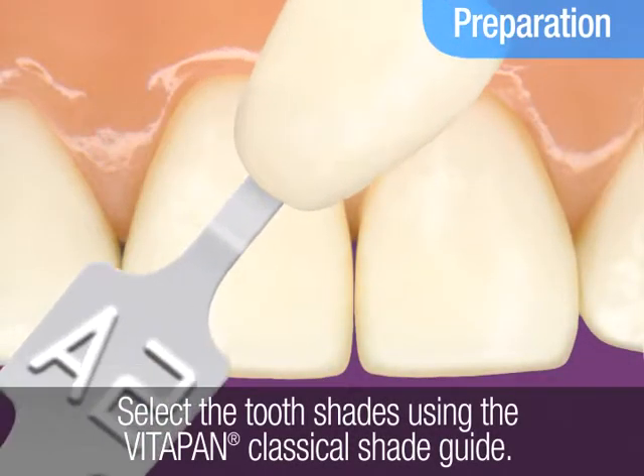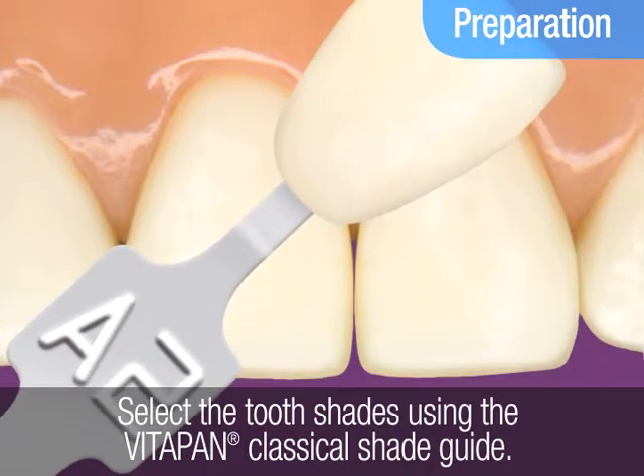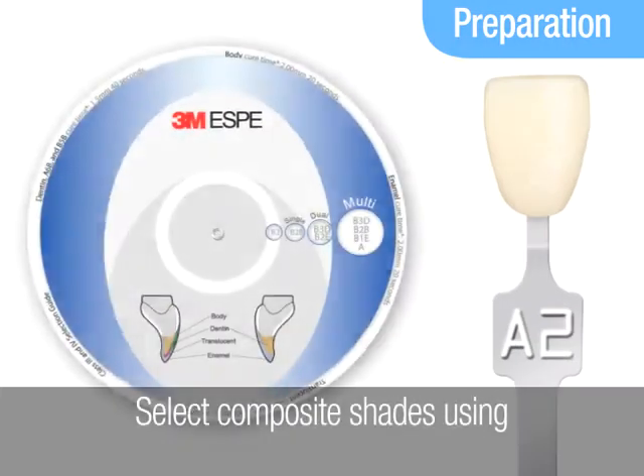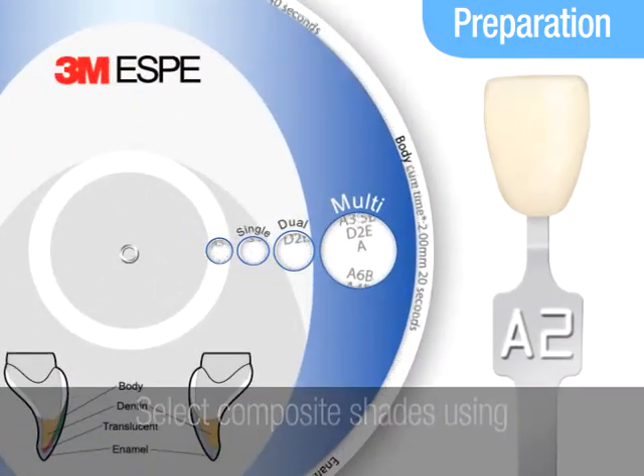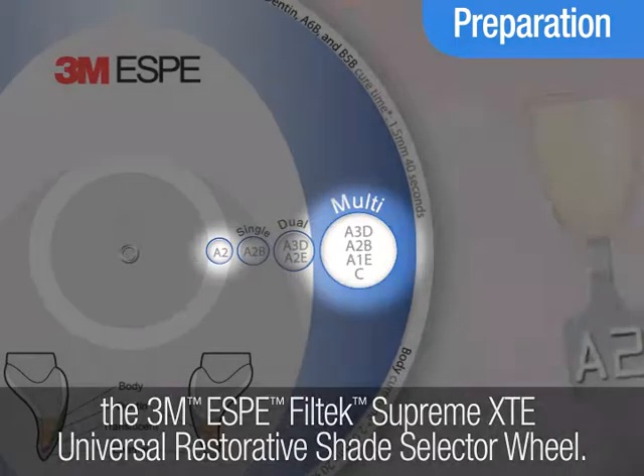Prepare for the procedure by first determining the patient's tooth shade using the VitaPan Classical Shade Guide. Then select the composite shades using the Filtec Supreme XTE Universal Restorative Shade Selector as a guide.